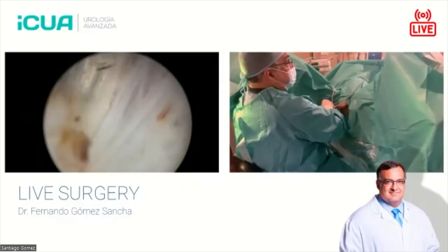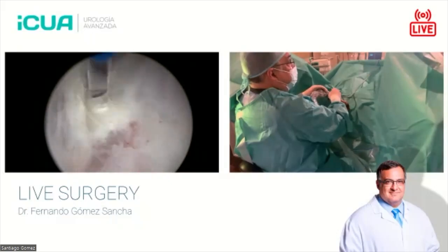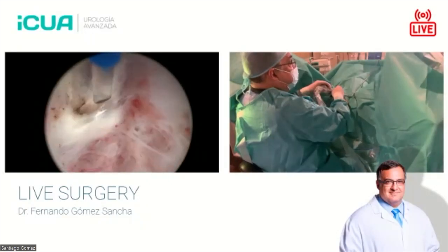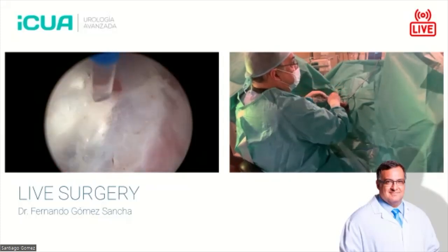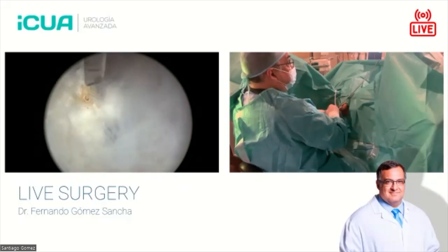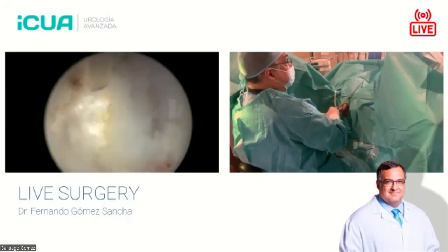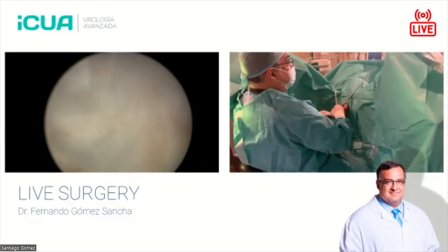So if I develop the plane with such care, at every point I just do a little bit of dissection. That means it's very rare that I'm going to cause a major perforation. And if I see that the capsule is thinning in some region, it's very easy for me to correct the aiming. I fire a little bit more inside. You know what I mean?